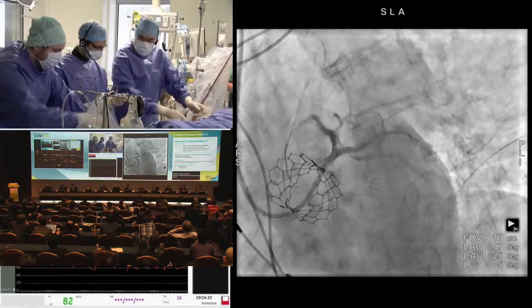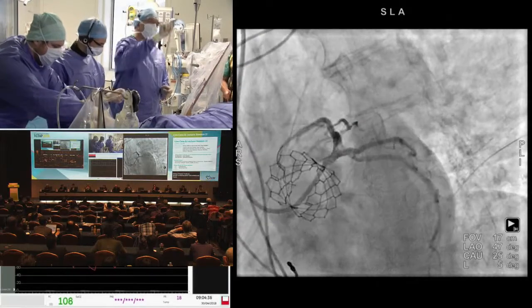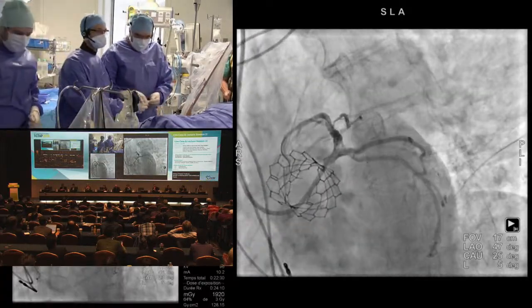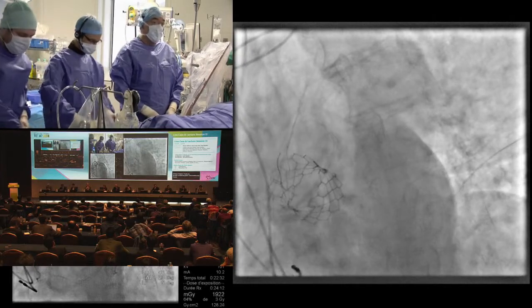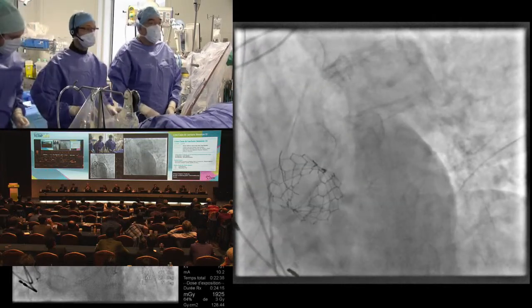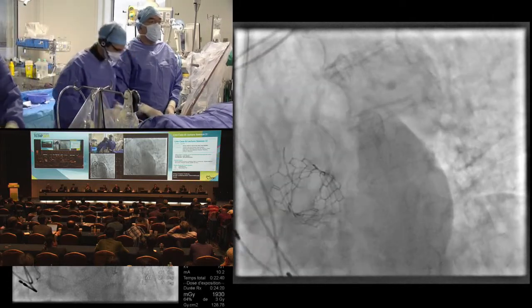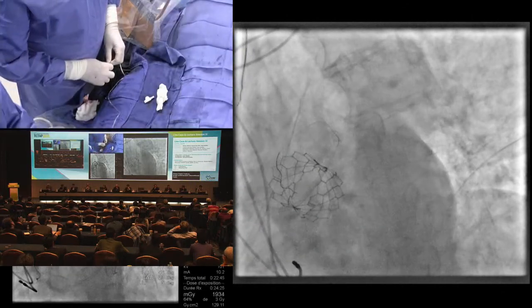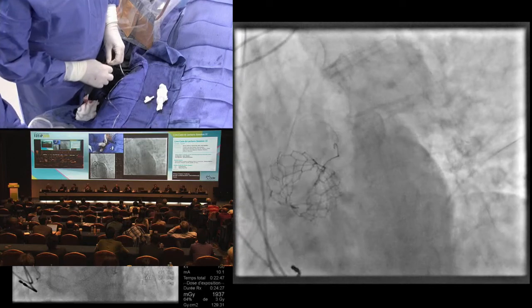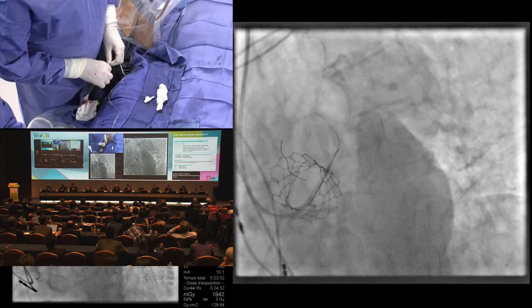Now the next step will be to recross the stent struts and place a wire again in the OM branch. It's a BMW wire, but if you want something else. No. We'll use the same wire, a BMW wire. It's possible to use a hydrophilic wire. Concerning the advancement of the wire, normally for the other techniques we try to go from the distal to the proximal. Here is a little bit different. We try to do from the proximal. Test slowly.